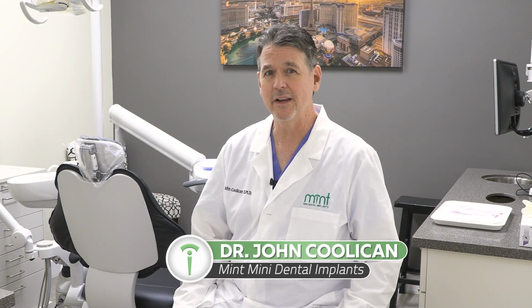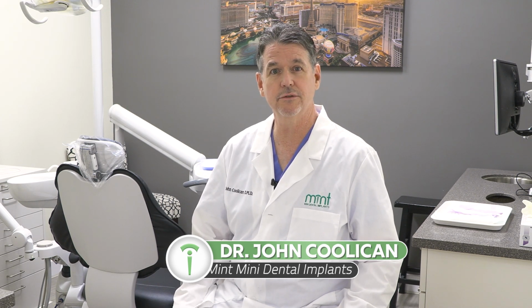A mini dental implant is a small-sized dental implant used to stabilize dentures or replace missing teeth. It consists of a titanium post. Titanium is the same material often used in joint replacements like a new hip or a new knee. It snaps into the denture and acts as an anchor for permanent teeth.